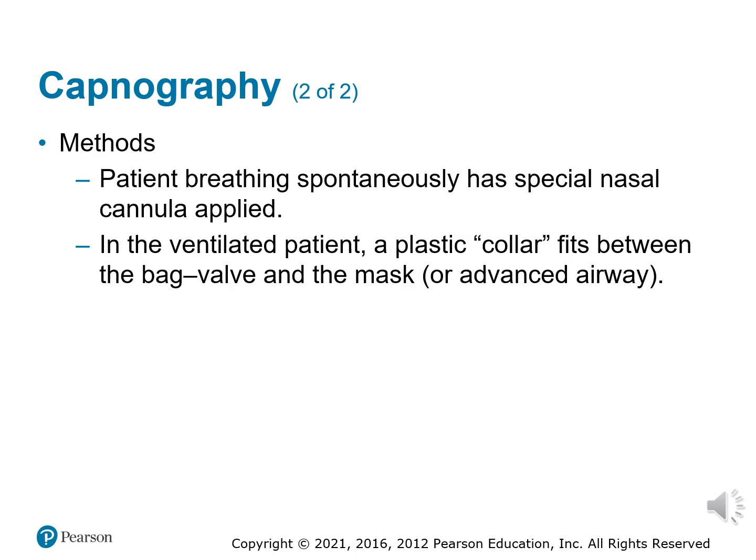So some methods that can be used: where the patient is breathing spontaneously, a special nasal cannula is applied that will actually measure the EtCO2. Or in ventilated patients, there is a plastic collar that fits between the bag valve and the mask or the advanced airway. So again, not all services carry it, but if they do, this is something to ask questions on and find out if you have it and how it's used.